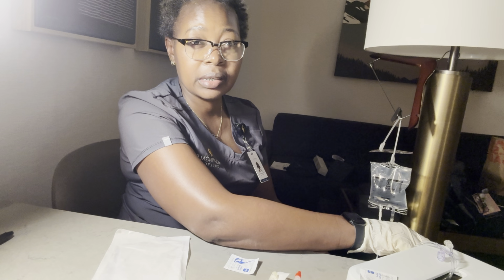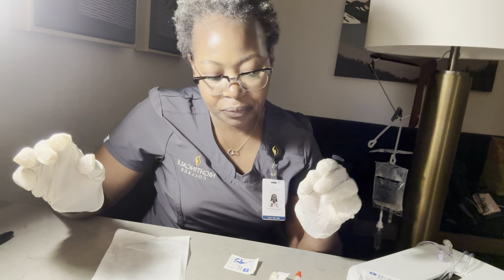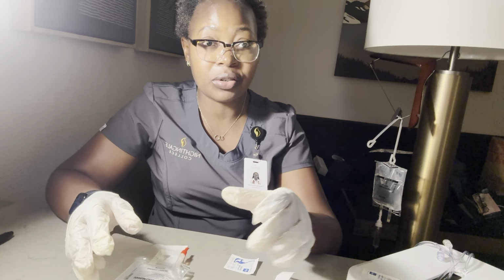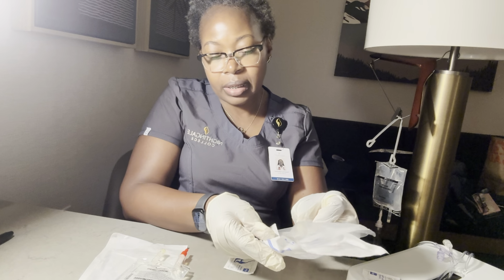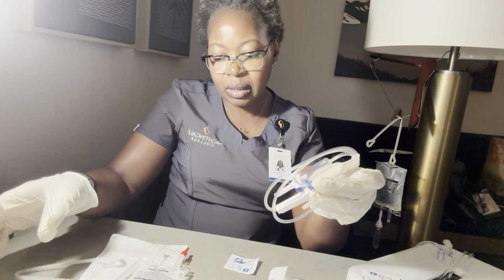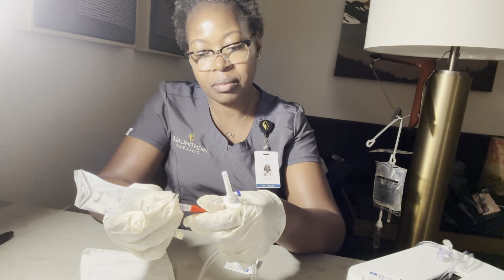Then I'll go ahead and take care of the amoxicillin. So with this, I also need to have it sterile. I don't want to introduce any dirt on my spike and the connection site, the Y site. So I'll go ahead and do the spiking and the priming.